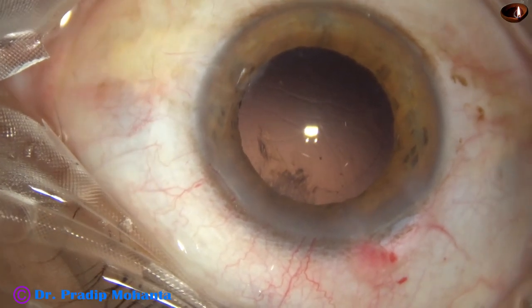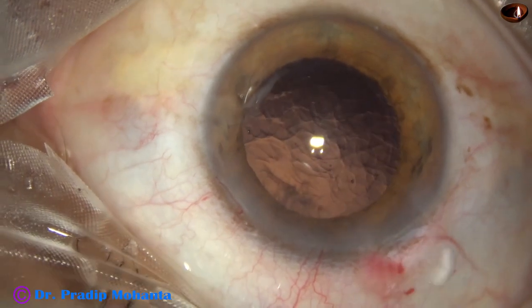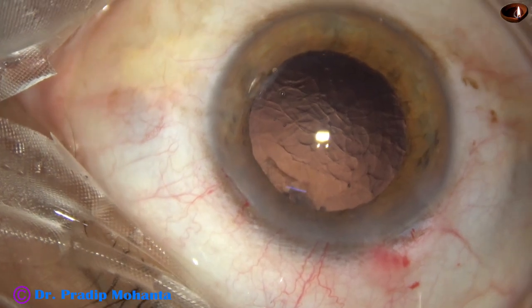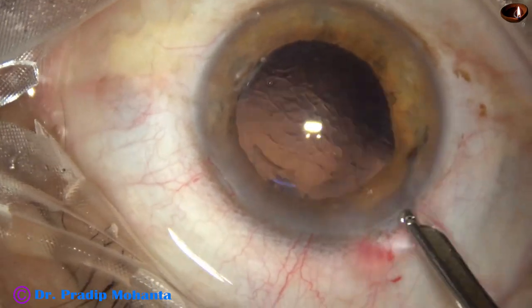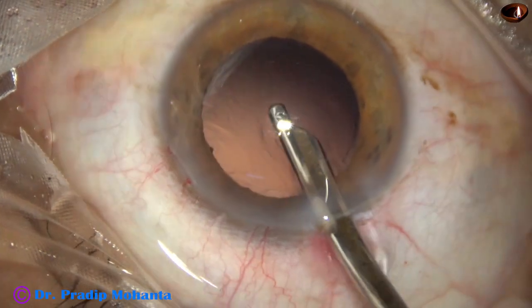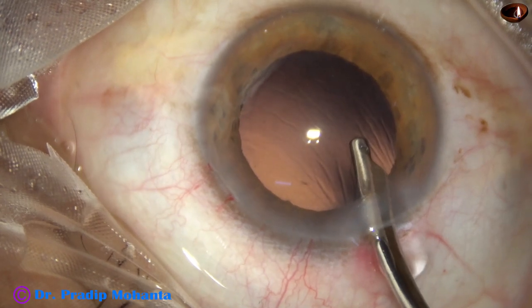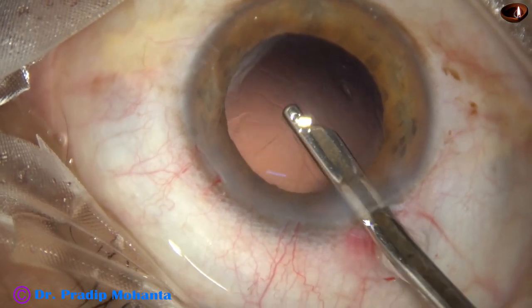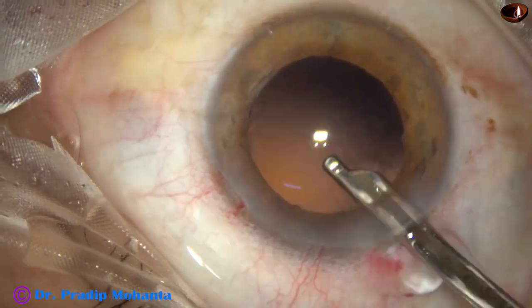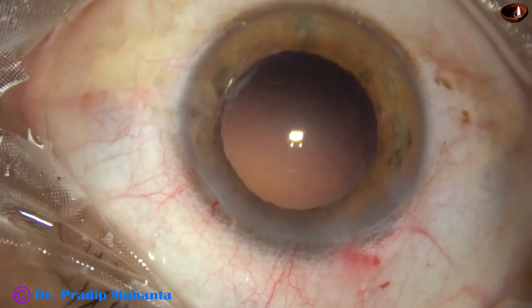Most of the lens matter has come out. A little bit of cortex remains at around 1:30 o'clock. I am going to remove this with a 22-gauge Simcoe cannula — and done. The posterior capsule is clear, with very little lens matter remaining. Almost clear posterior capsule, no fibers seen.